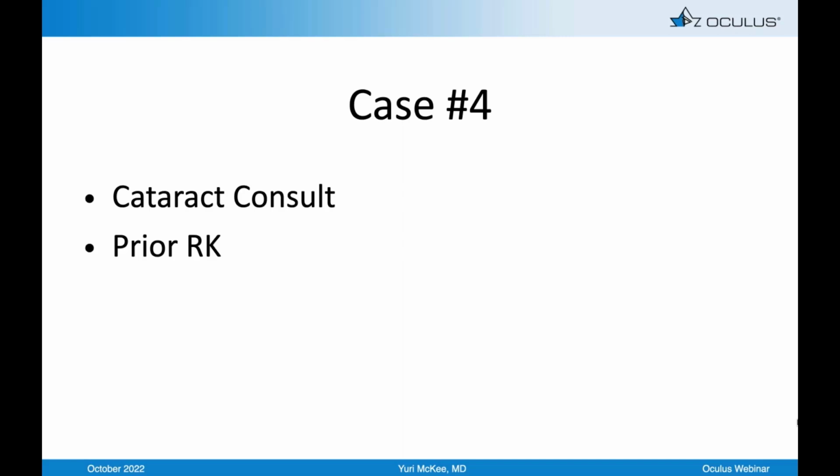And so the other thing is that sometimes you see these higher order aberrations that are kind of borderline. You can change the aperture size within the Pentacam and see what would the higher order aberrations be in a smaller pupil size, and you'll see it'll get smaller quickly. In that case, you might make the excuse that you're going to maybe proceed on a borderline case because you know that they never drive at night and their pupil's always smaller. But in general, when we're speaking, we have to speak the same language. It's a 6 millimeter aperture or pupil size for higher order aberrations.